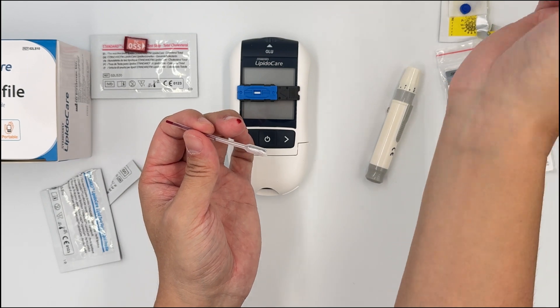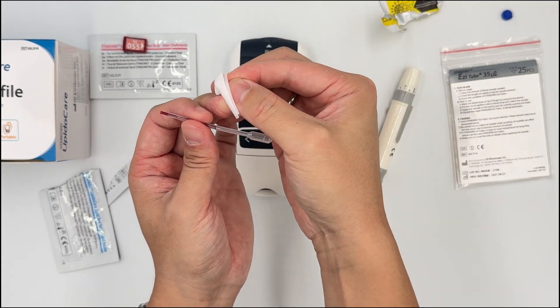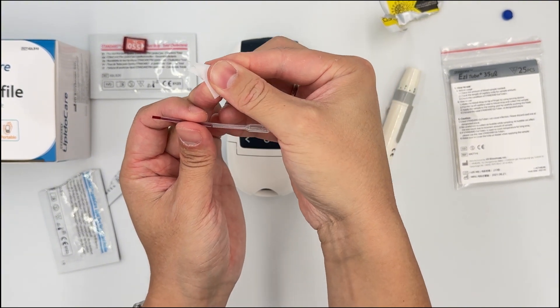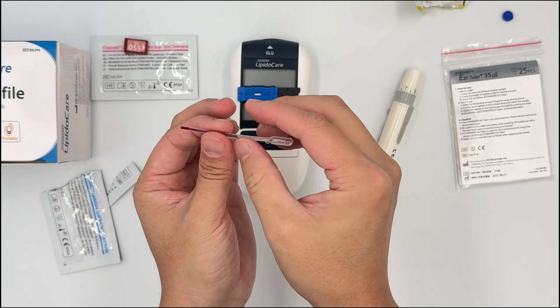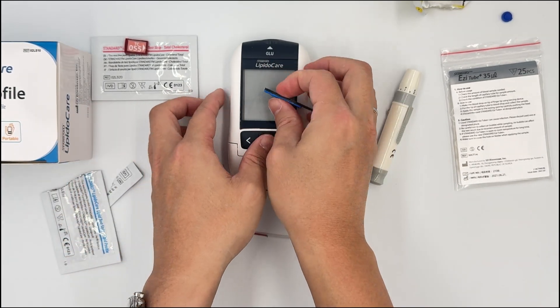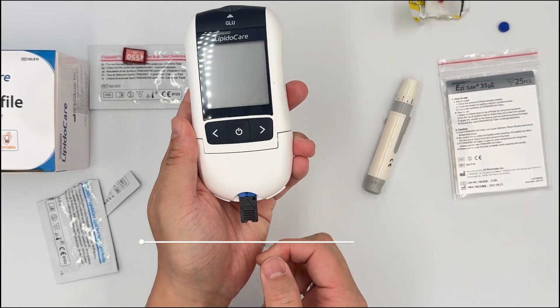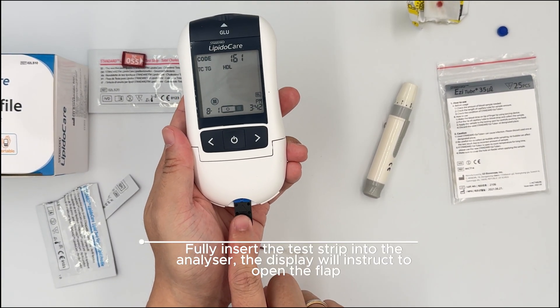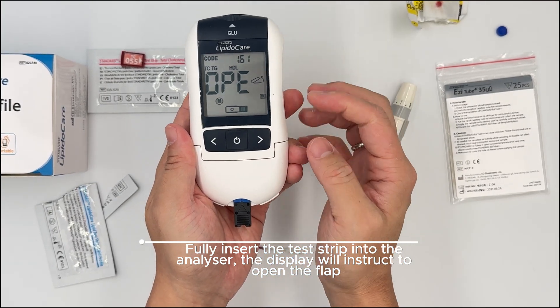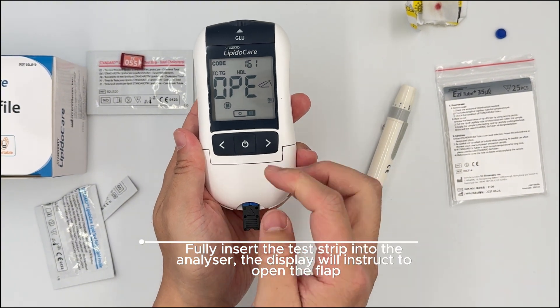At this point, to stop your patient from bleeding, give the alcohol swab back to the patient so they can press the wound. Then gently put the easy tube down on your table and with both hands, push the strip into the meter — it will switch on by itself. Do not open and put it in; just push it in, and it will say 'open'.